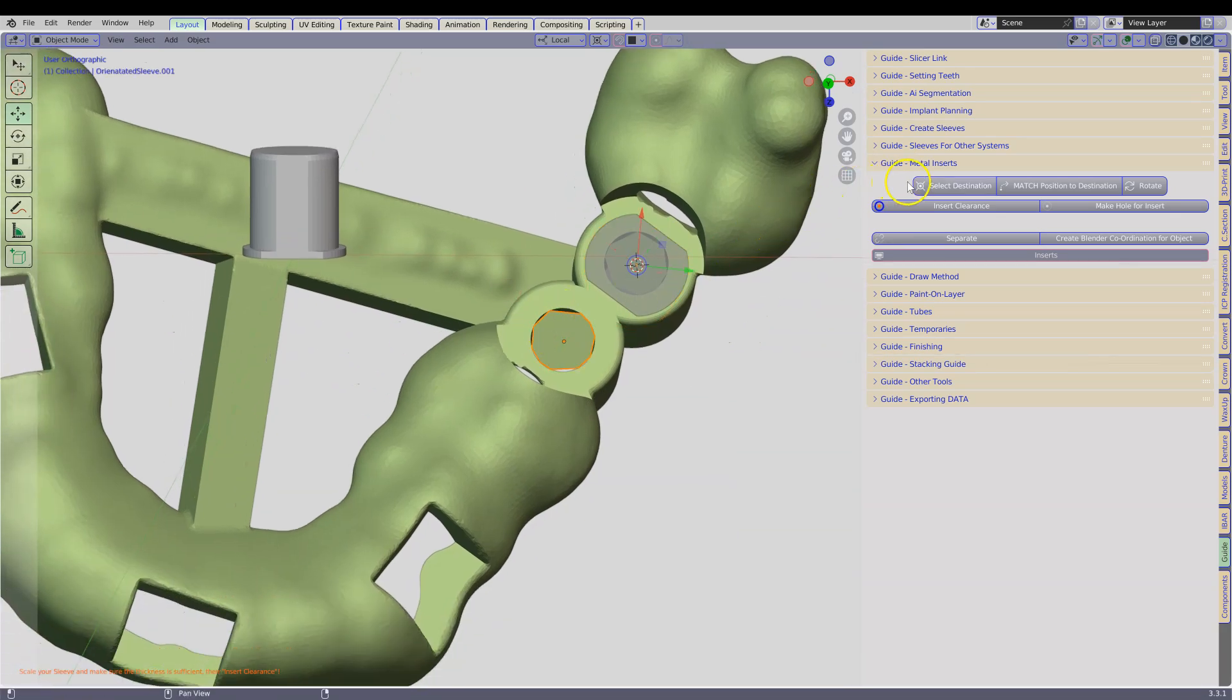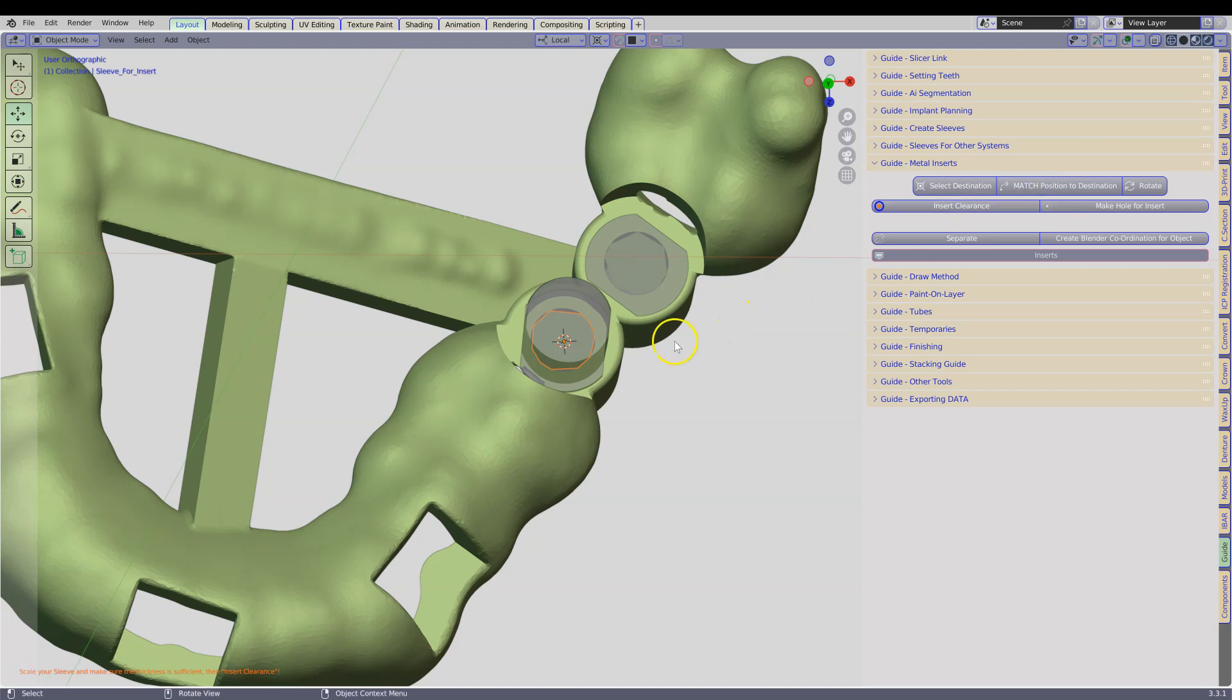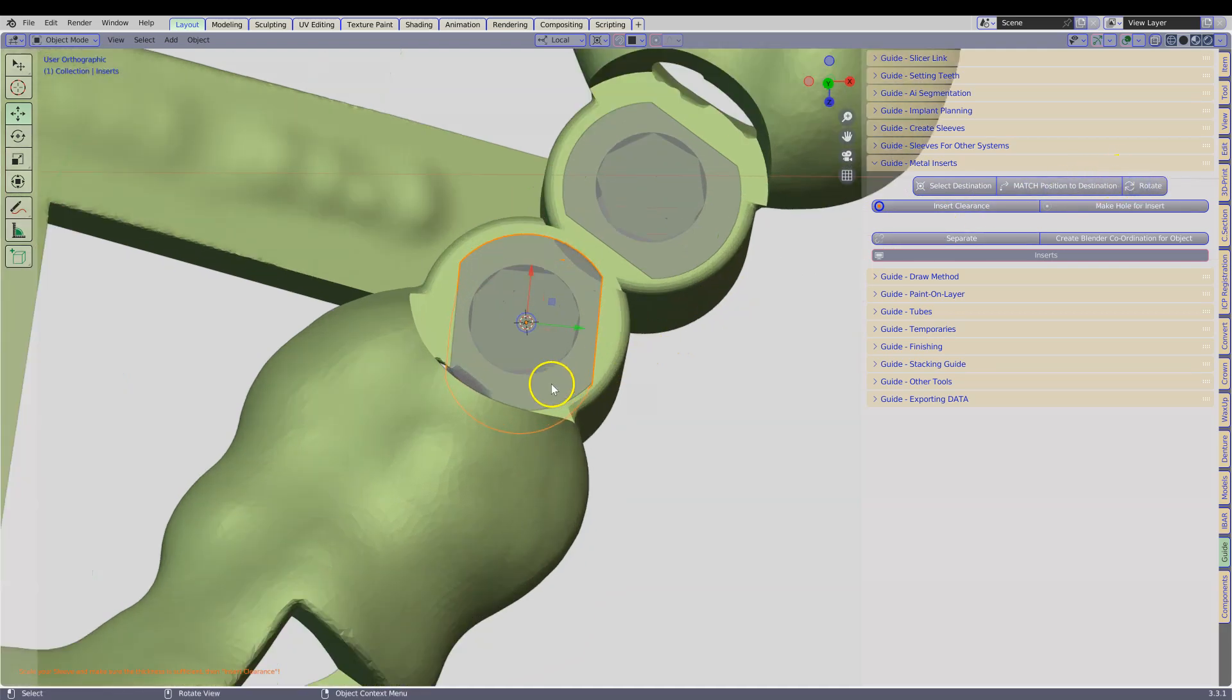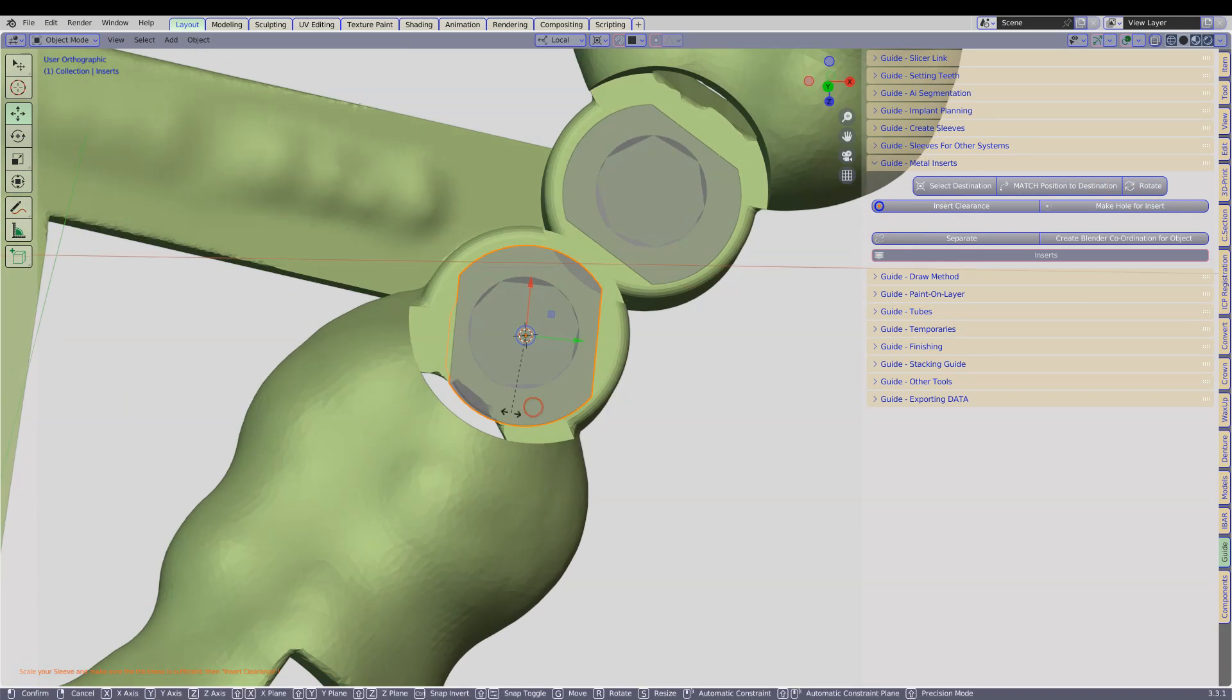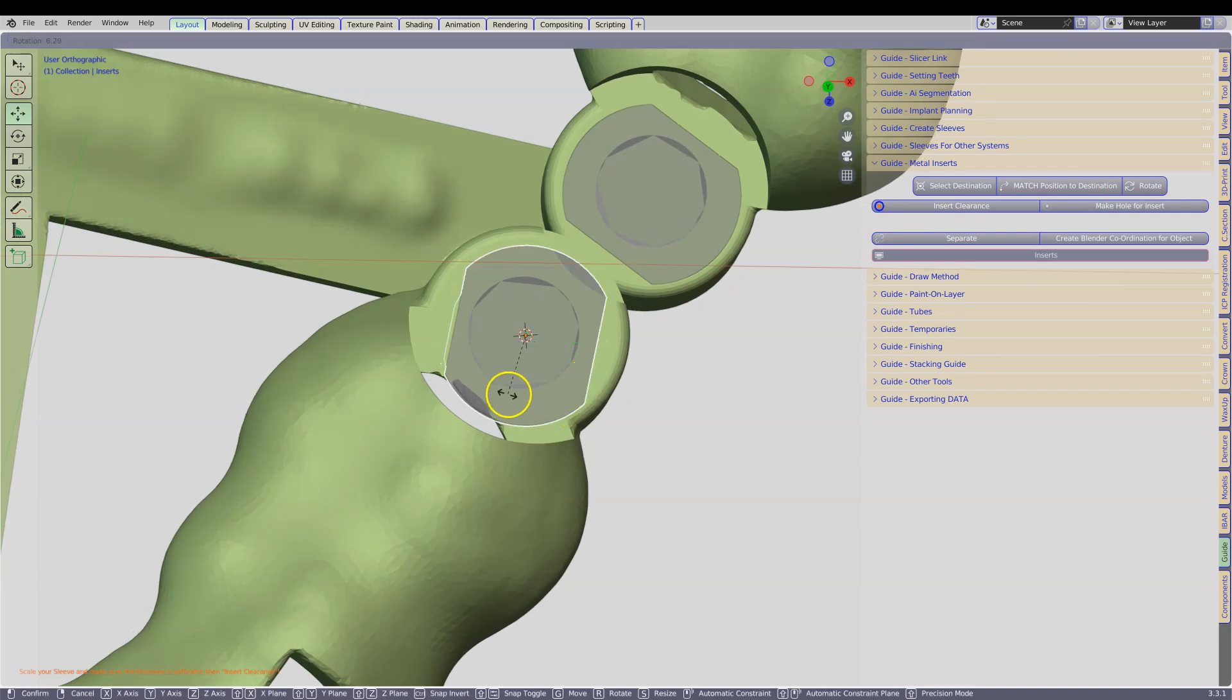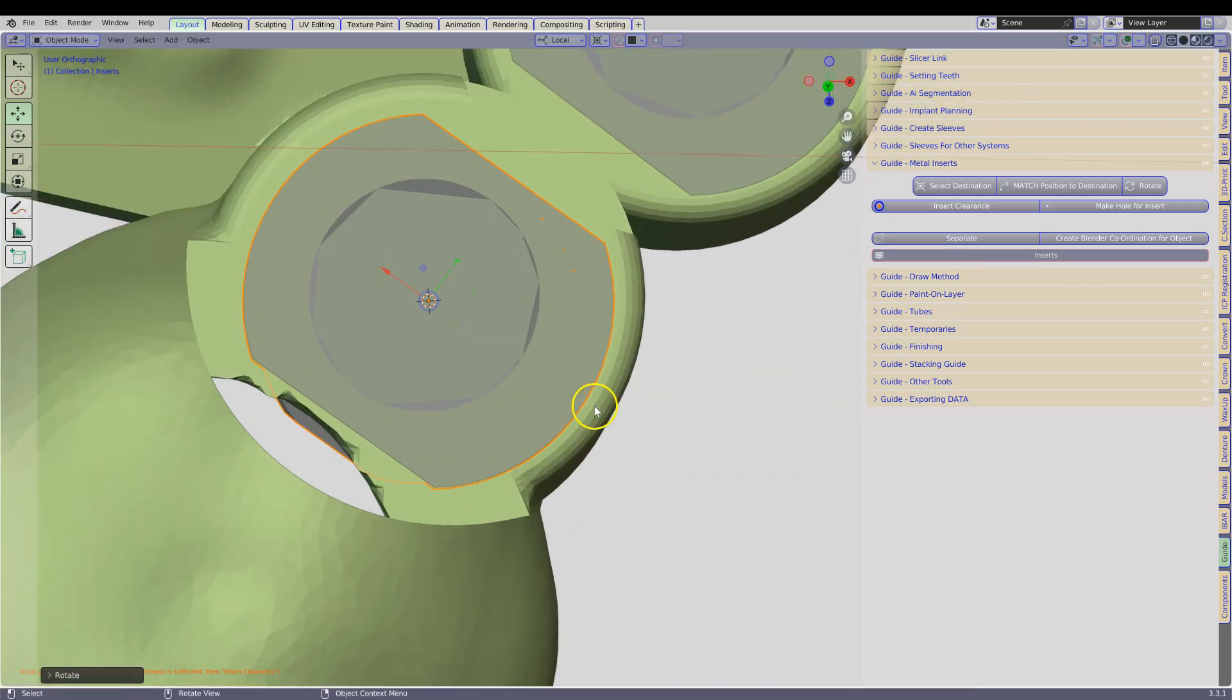This is our destination. Select that one, and then match position to destination. Same thing, rotate it around. And then R key to rotate it. Now we can see there is not much space going around here.